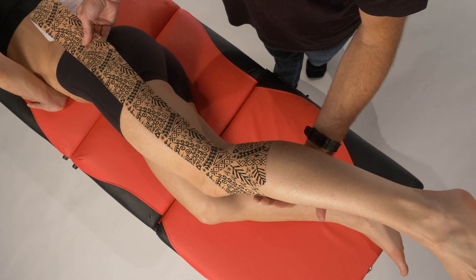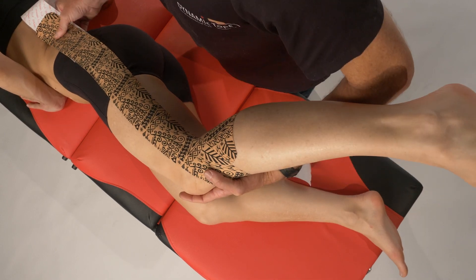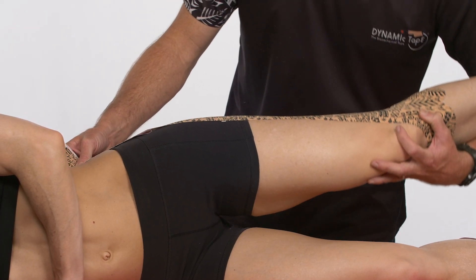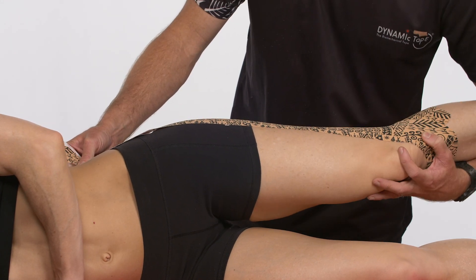Then we're going to come up over the greater trochanter. We can keep this intact in one piece and that's going to resist that hip from dropping into adduction.